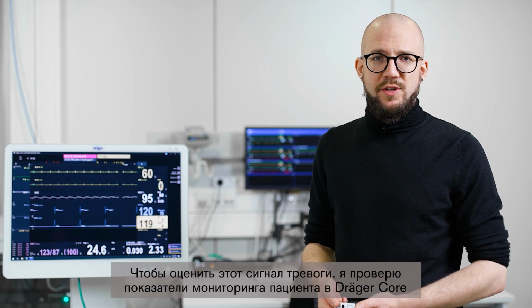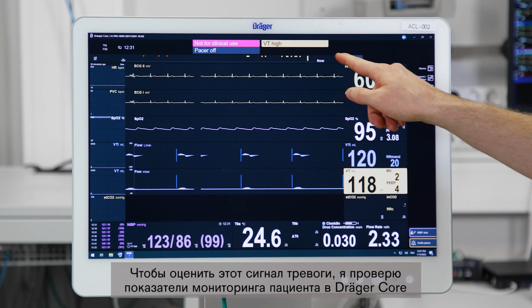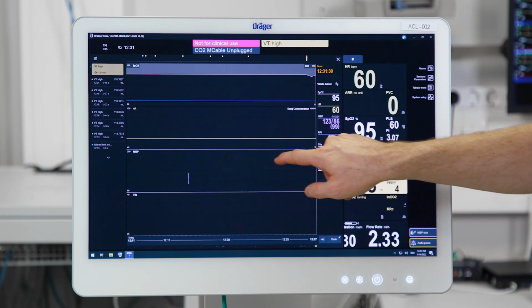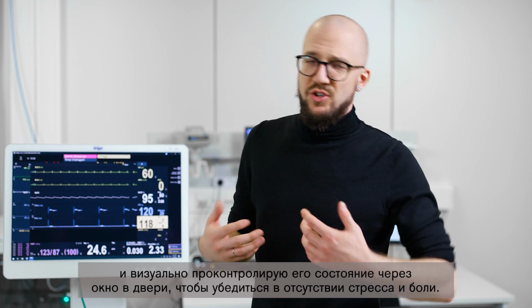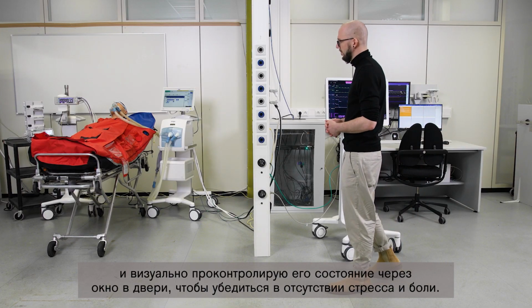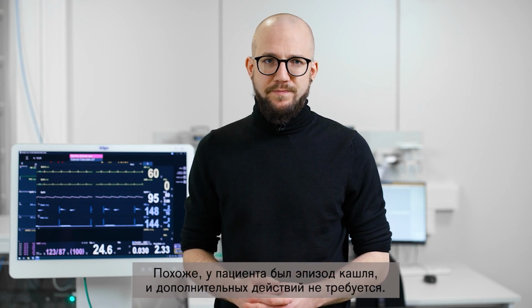To check now the urgency of this alarm, I will use the core to check vital signs of my patient, as well as visually check through the window of the door that my patient is stress and pain-free. It looks like the patient just had coughed, so this requires no current action.